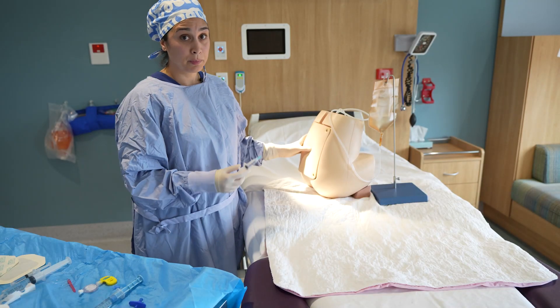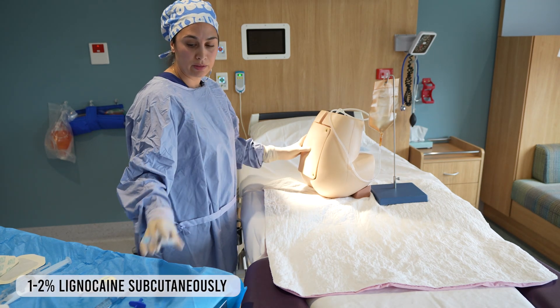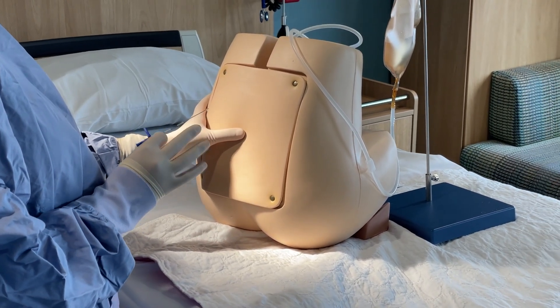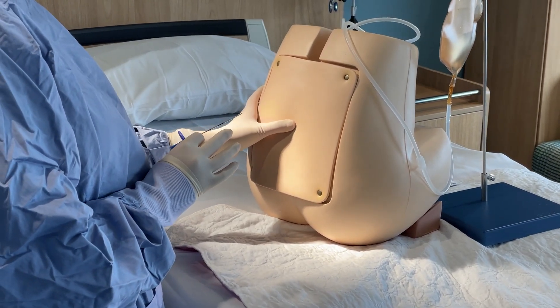After prepping the back and putting the drape on, the first step is a bit of local anesthetic in the skin. Allow some time for it to work, then prepare the patient. Tell them: 'We're going to be doing the epidural now. I need you to give me your best position and stay really still. Let me know if you need to move for any reason.'